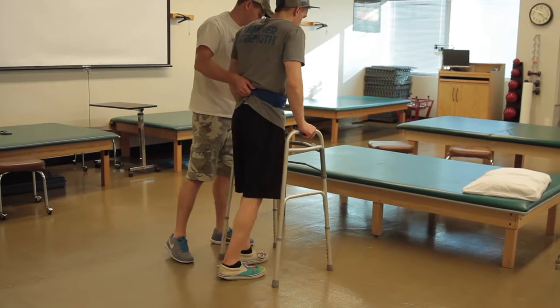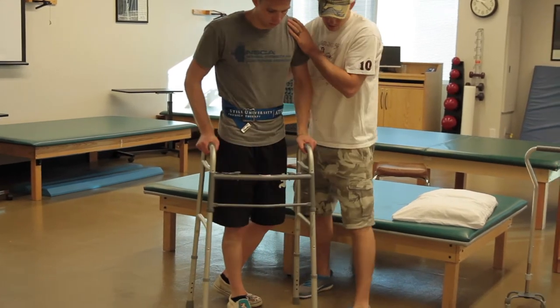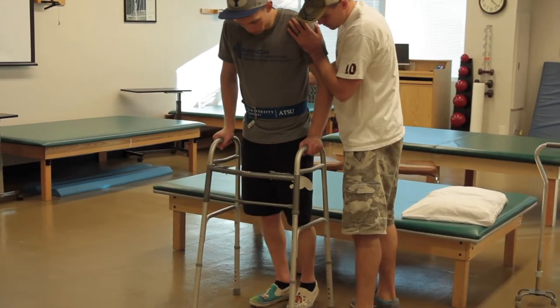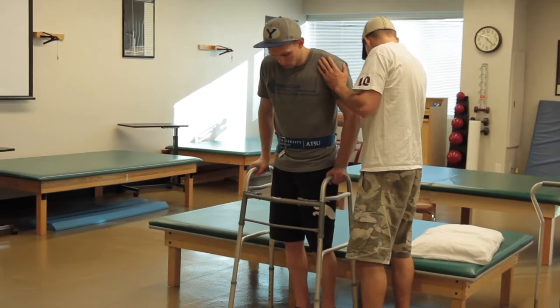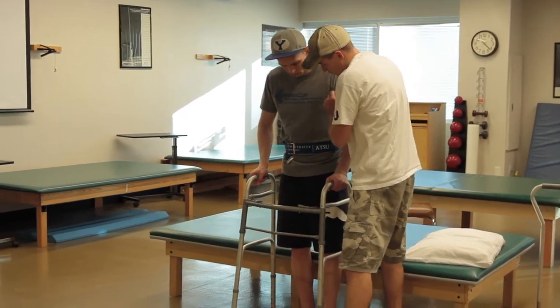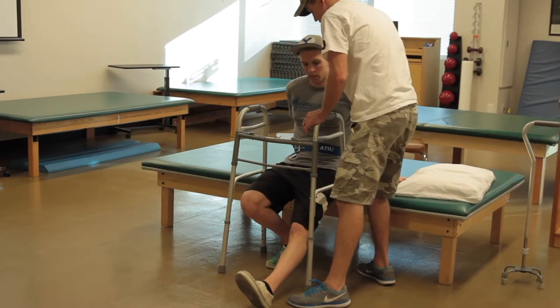All right, go ahead and make another turn to your right. All right, now this way you're going to go backwards. When you back up, you're going to go back with the right leg first, and then the left, and then bring the assistive device up. And make sure those legs touch. Perfect. So now, maintaining that angle again, we're going to sit down, use your right leg to lower, and then keep that leg out straight. Perfect. Feel okay?